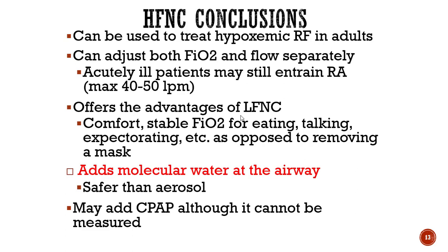If you're looking at a high flow nasal cannula versus a high concentration mask, the reason that patients like it is because it's comfortable. You still get your stable FiO2. They can eat, they can talk, they can spit up their secretions without having to constantly be taking a mask on and off.